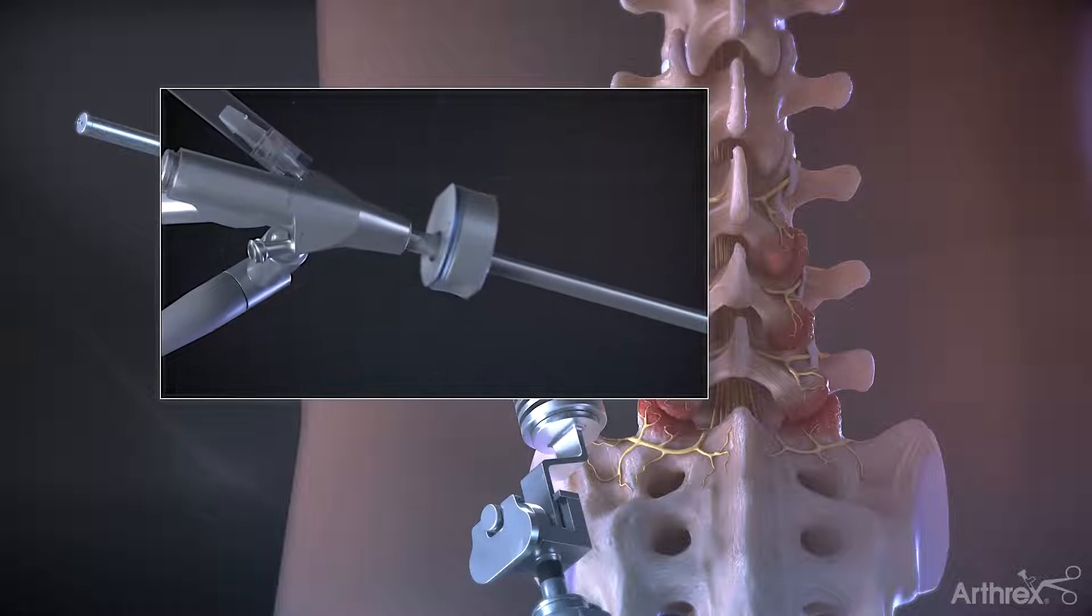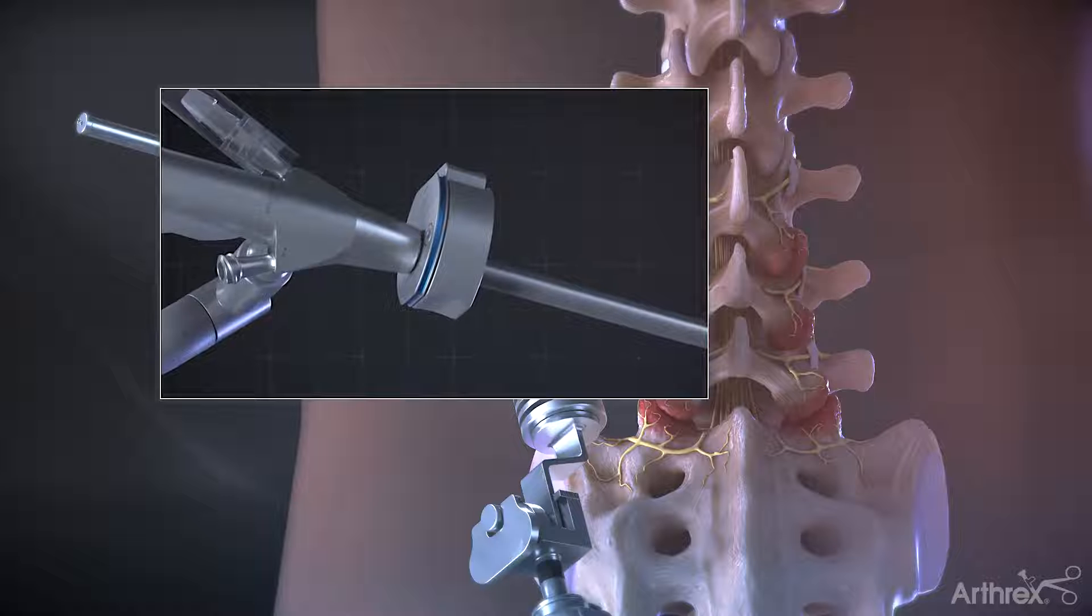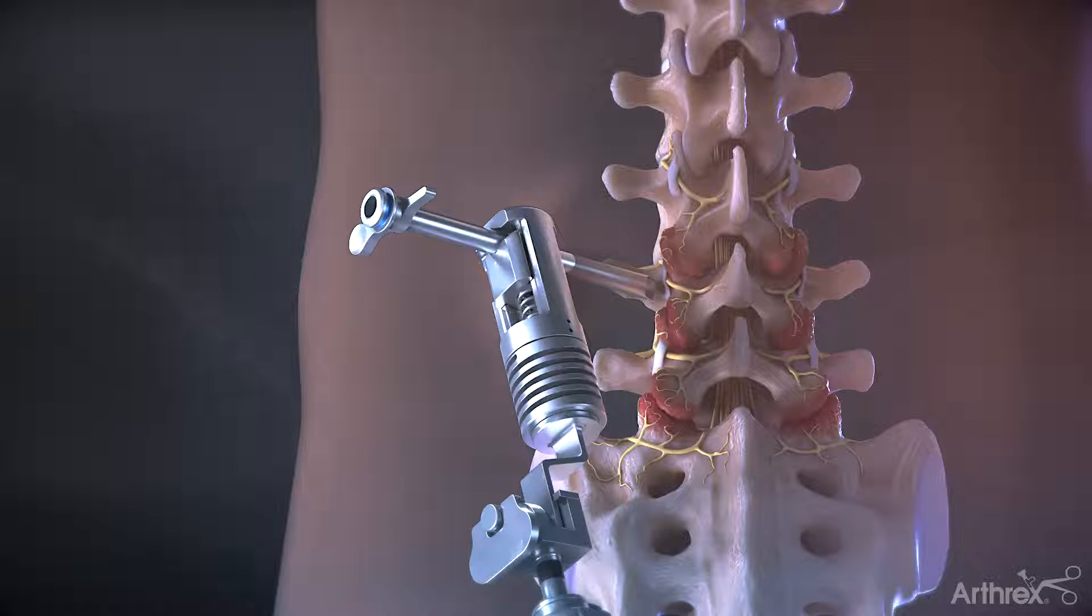Attach a depth stop to the endoscope to maintain the depth within the cannula. Remove the switching stick and insert the endoscope.